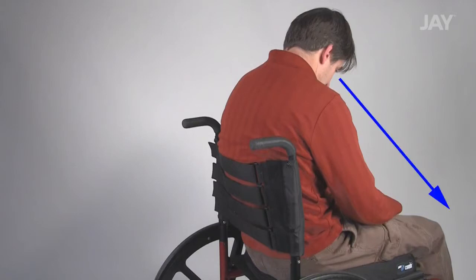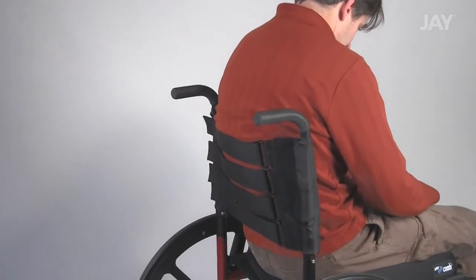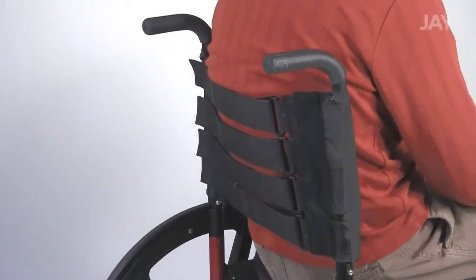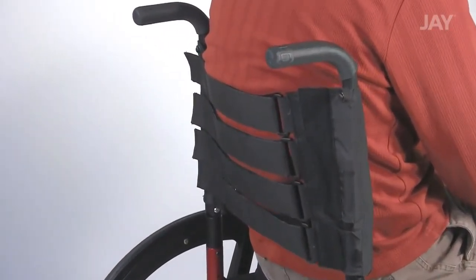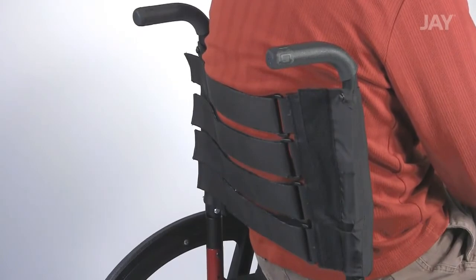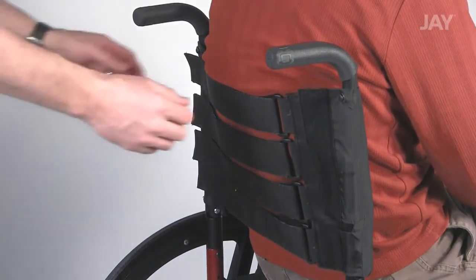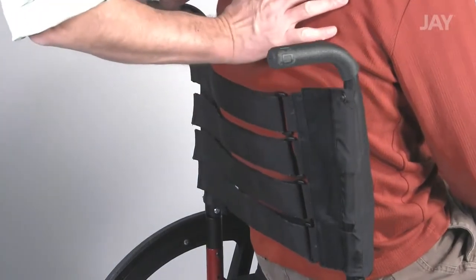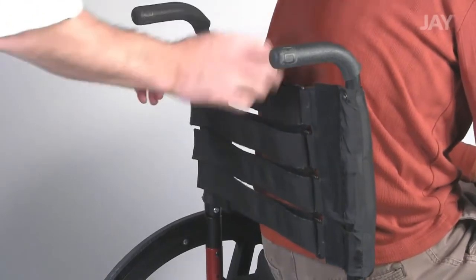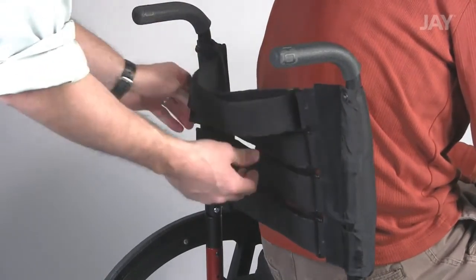As we zoom in, you can see four individual adjustment straps. By moving the user away from the straps and adjusting each strap to a different tension level, the angle of the backrest is changed while the user is still sitting in the chair.